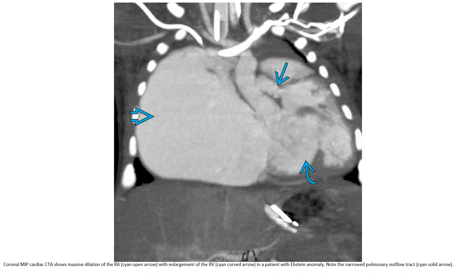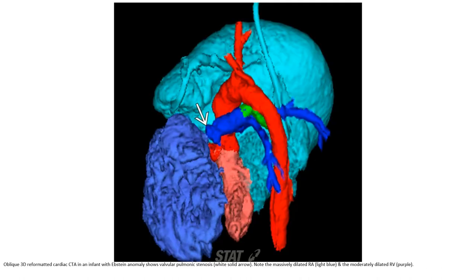Axial cardiac CTA shows massive dilatation of the right atrium with enlargement of the right heart in a patient with Ebstein's anomaly. Note the narrow pulmonary outflow tract. A reformatted cardiac CTA in an infant with Ebstein's anomaly demonstrates subvalvular stenosis, a massively dilated right atrium, and a moderately dilated right ventricle.